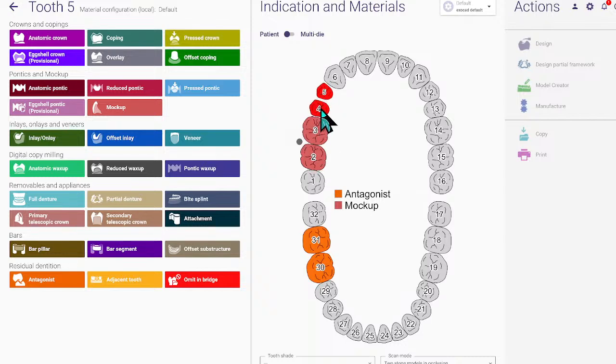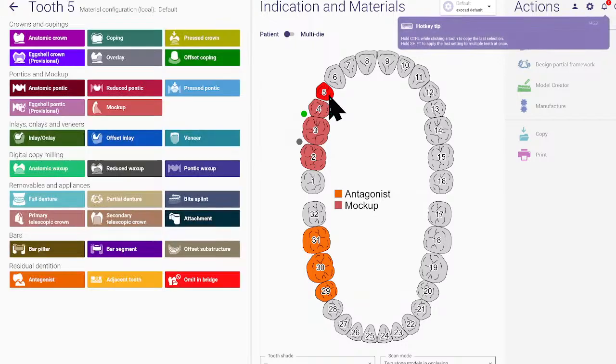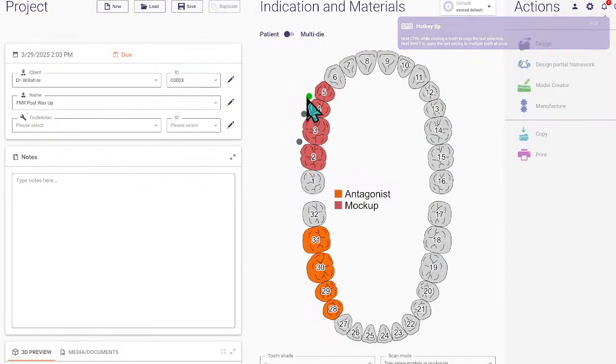For my specific case, I'm bringing all this together. So this. Then I'm doing another 3D print mock-up, yes. And then also include this one. And 3D print, okay. You wanna uncheck these, or you could leave it linked, it's up to you, that's optional. I haven't had any problems leaving it unlinked. So again, I'm new to EXOCAD, so you'll just learn with me. So that's how I did my case and practice on.